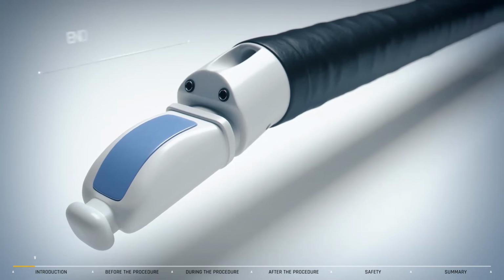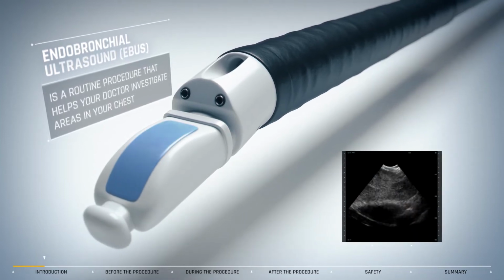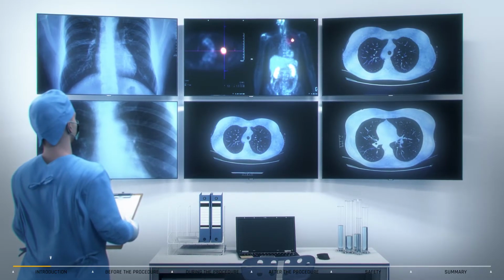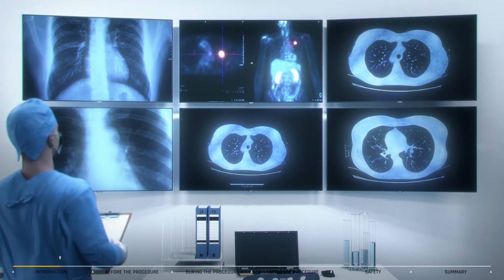EBUS is a routine procedure that uses a flexible tube with an ultrasound probe attached at the end to create images of lymph nodes in the chest and other nearby structures. Ultrasound imaging allows your doctor to accurately locate and examine areas seen on CT scans that need a closer look.